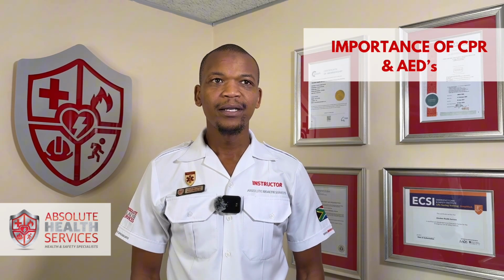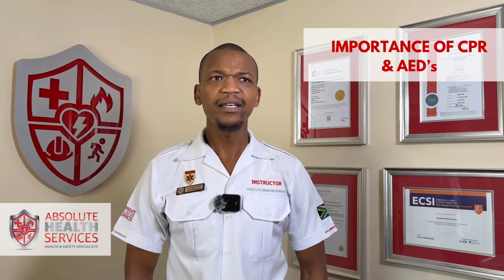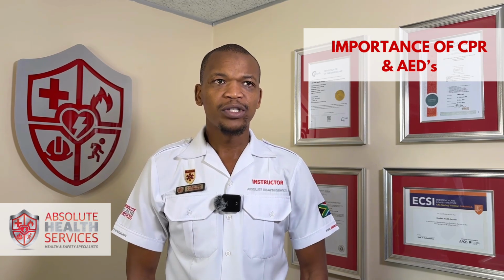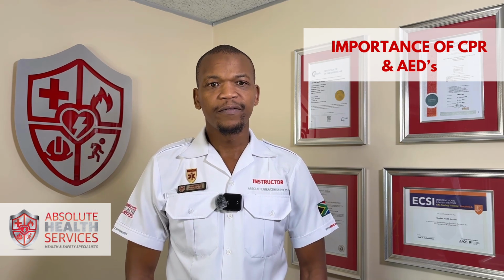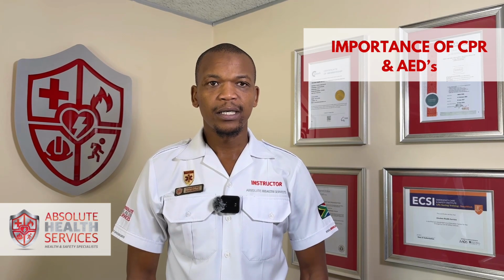Right, so let us look quickly at when one needs to perform CPR and use an AED. Mainly in a case of cardiac arrest, where a person's heart stops or starts malfunctioning due to the heart being damaged or there is a blockage. One can even talk about what we regard as AMI, which is acute myocardial infarction, where the heart actually stops as a result of a blood clot.